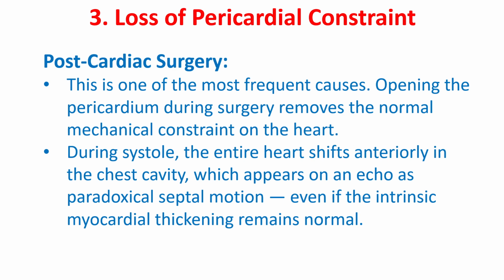Opening the pericardium during surgery removes the normal mechanical constraint on the heart. During systole, the entire heart shifts anteriorly in the chest cavity, which appears on an echo as paradoxical septal motion, even if the intrinsic myocardial thickening remains normal.